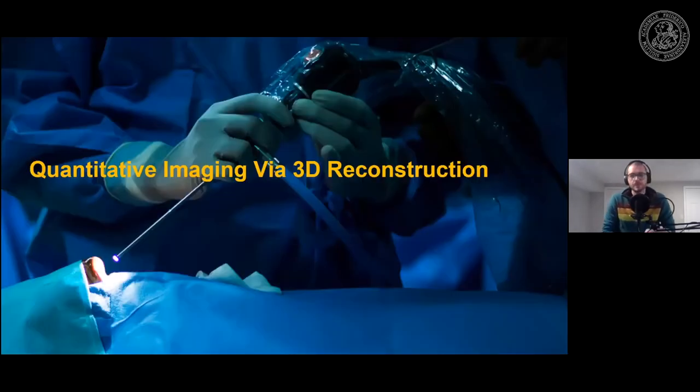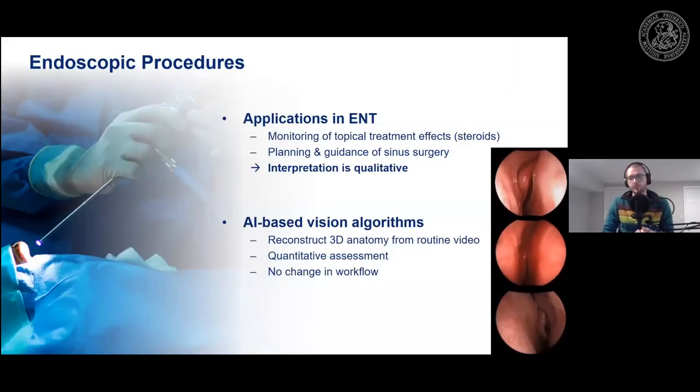Okay. So this is the first application that I wanted to talk about, and I will spend the next couple minutes talking about something that is related in the way that it also differentiably connects 2D and three-dimensional domains, but it's in a completely different example. And here we're going to talk about quantitative imaging via 3D reconstruction in the context of endoscopic procedures.